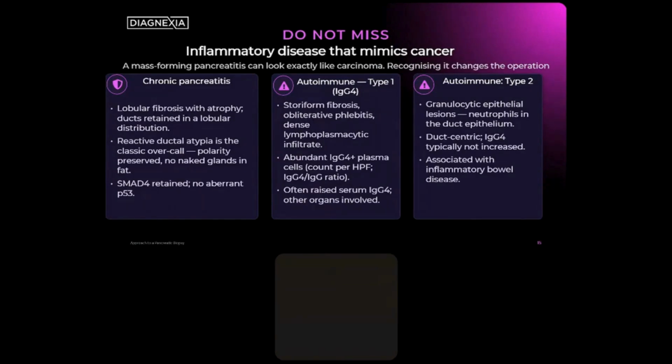Now, reactive ductal atypia: the cells have every reason to react to inflammation and show nucleomegaly, and can show nucleoli, and can show mitotic activity. But generally speaking, all the features that are described in an adenocarcinoma, and I will enumerate them later on as well, just for clarity, are not seen in chronic pancreatitis, or if some of the features are seen, not to the extent that you would see in an adenocarcinoma. And generally, you will see the glands are somewhat well differentiated, whilst there may be a degree of loss of polarity. It's really still confined to the lower part of the cell.